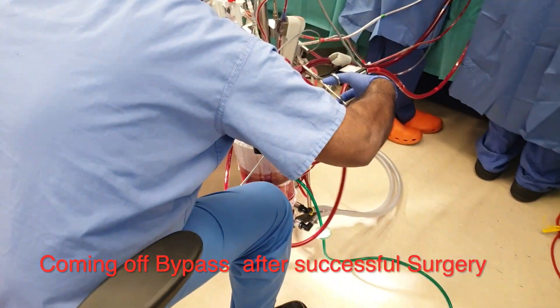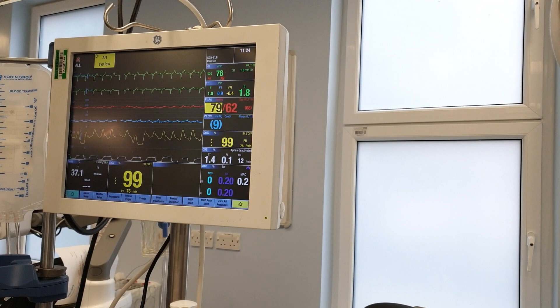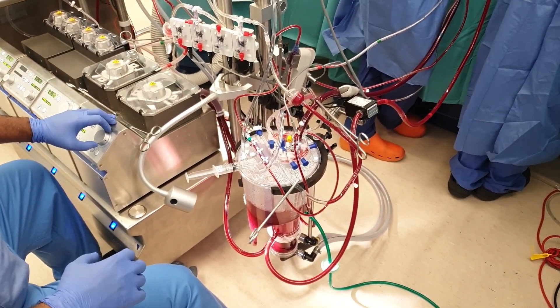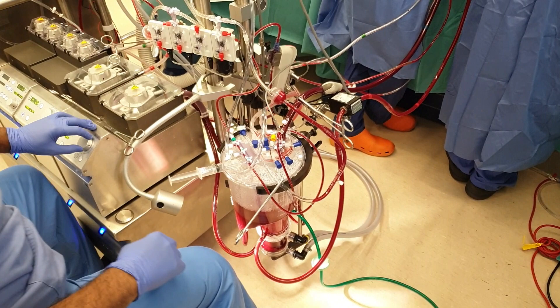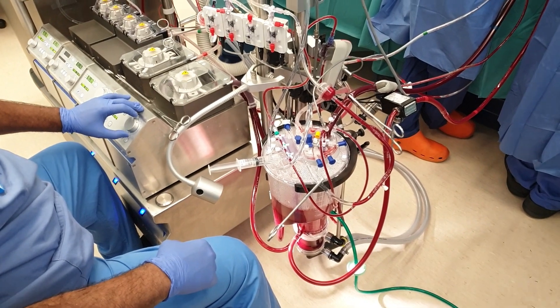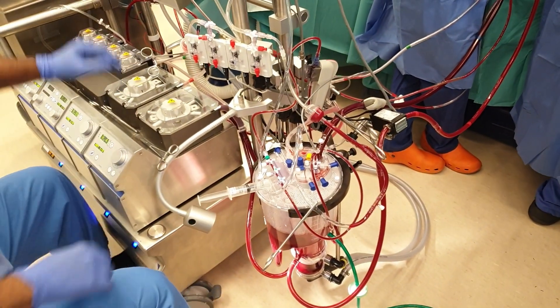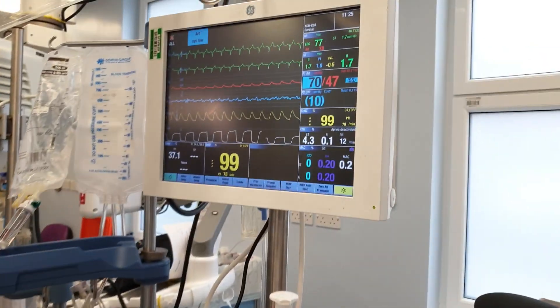Okay, I am going in the back. Happy with the ventilation? Yes. Down to three for the floor. Okay, down to half. Coming down? Yes sir, forward. Down to quarter. I can come off and give you some volume. Okay. Venous lines clamped, off bypass. And de-airing.